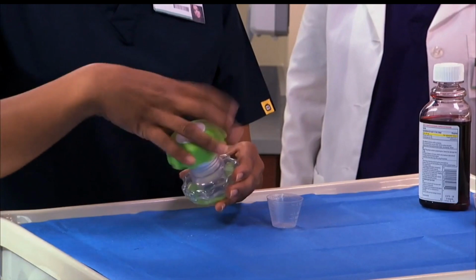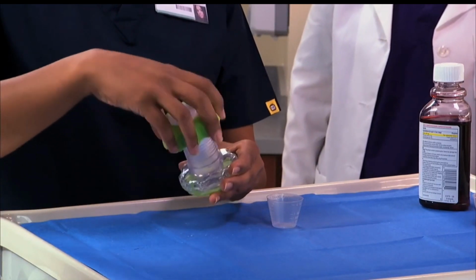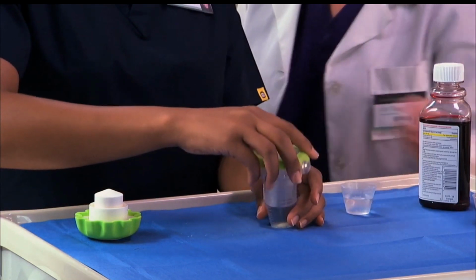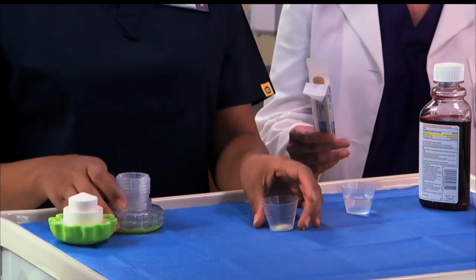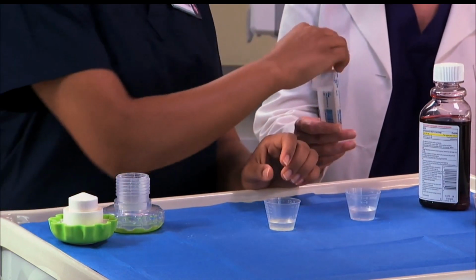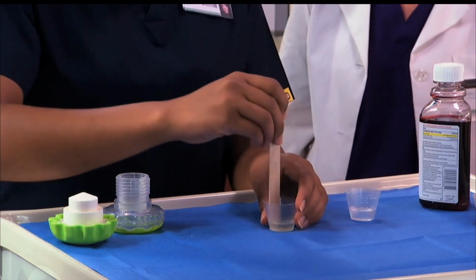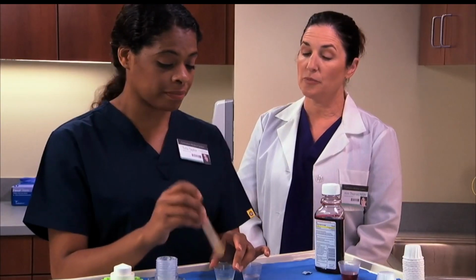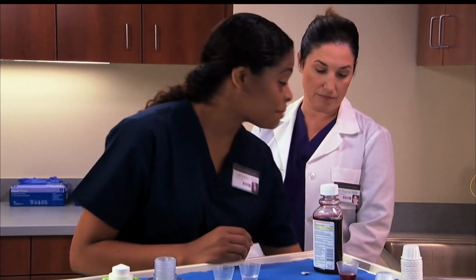The tablet is ground. Now I dissolve in water, right? Yes, pour the powder into a plastic medication cup and dissolve in a small amount of water. Then keep the medication wrapper with the dissolved tablet so we can recheck the medication before we give it to the patient. Any additional meds for now? That's it for this time period.